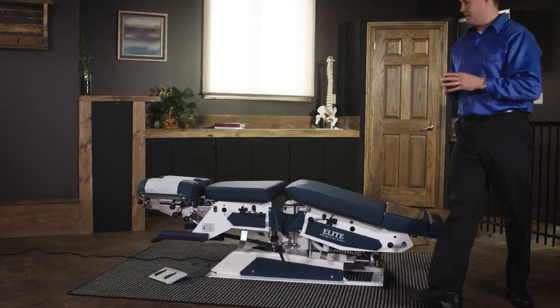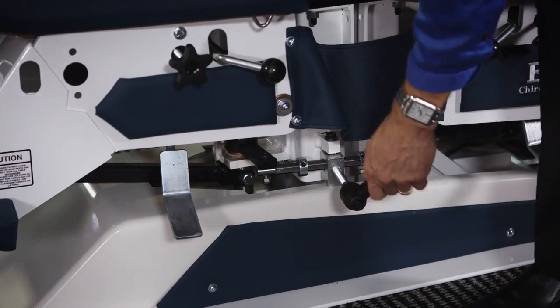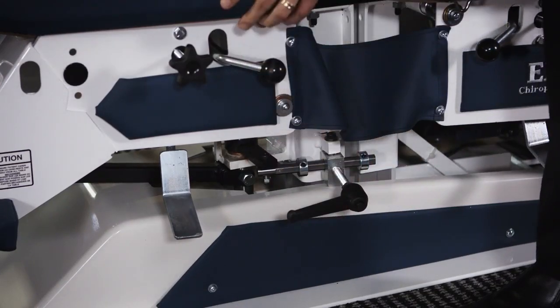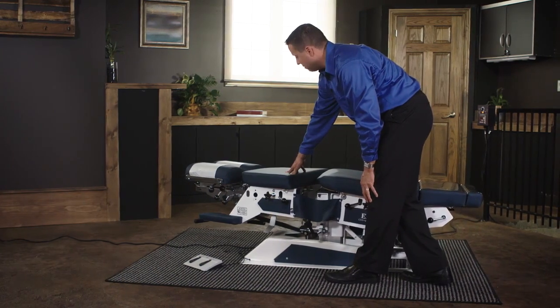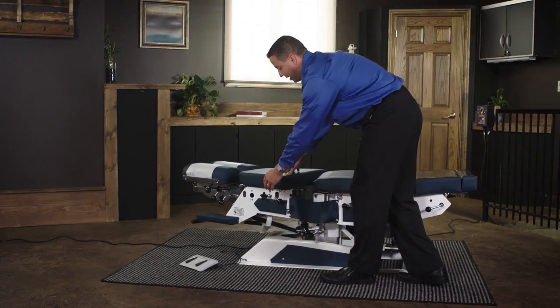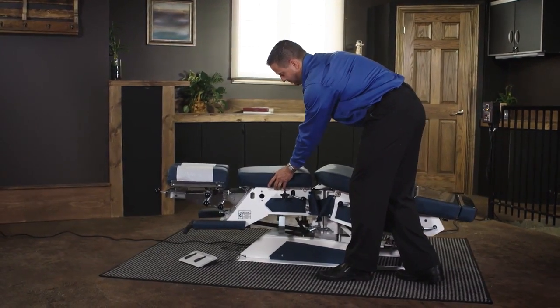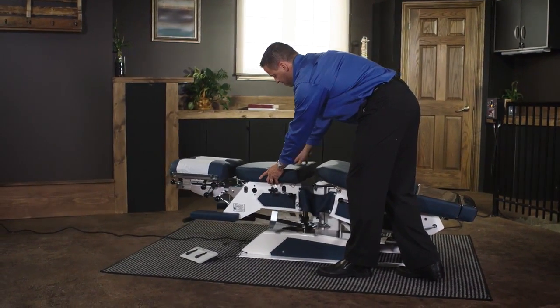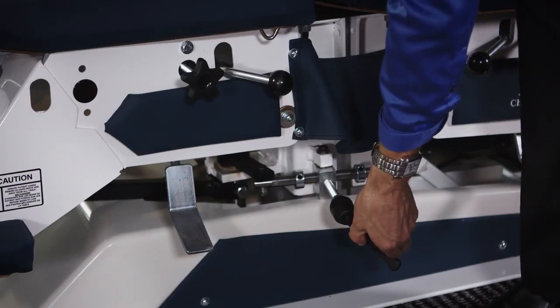Lateral flexion with this table is achieved by simply unlocking the lock and moving the upper part of the table to the desired position. Right now we are creating right lateral flexion, and this can also be done in left lateral flexion. We then lock it back out into its neutral position.